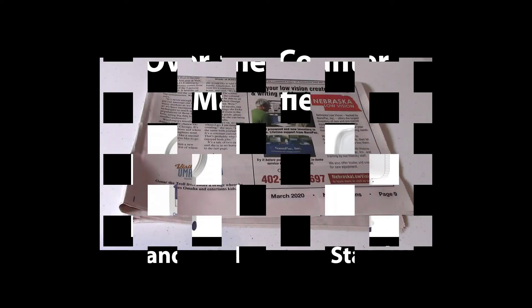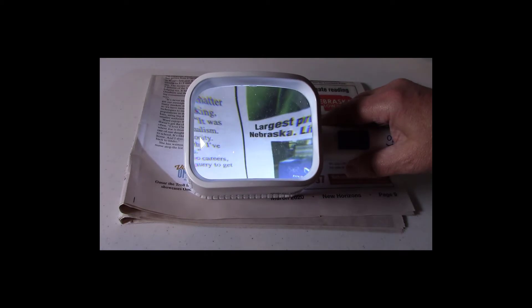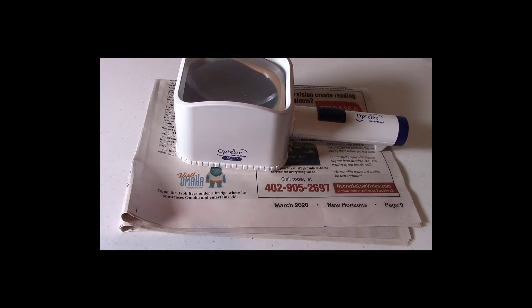Watch this video about over-the-counter magnifiers and then I will come back and tell you the best place to purchase these. Over-the-counter magnifiers are very useful for persons with low vision, stamp, and coin collectors too. Not all over-the-counter magnifiers are the same, which this video will explain. There are several differences that separate over-the-counter magnifiers from each other.